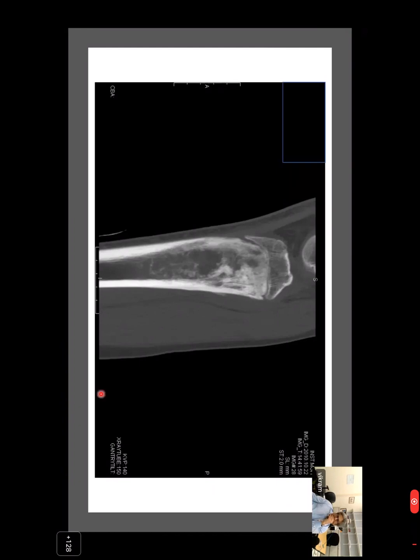Sir, I have a small comment to make. Yes, go ahead, Manish. So Sharmila, your diagnosis as far as the pathology is concerned was quite correct in terms of you have diagnosed it as a fibro-osseous lesion. Yes. Okay. So the problem is when you sign out the report, because it is not fitting into the radiology, your differentials. So that is where you should remember the common locations and the age of the patient.